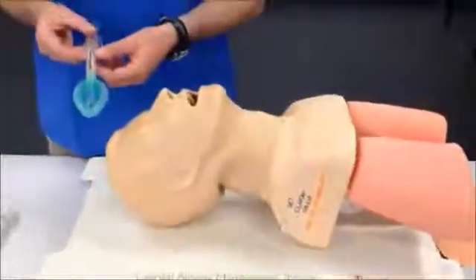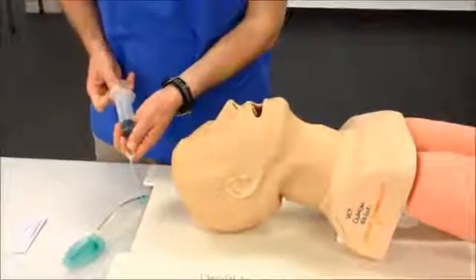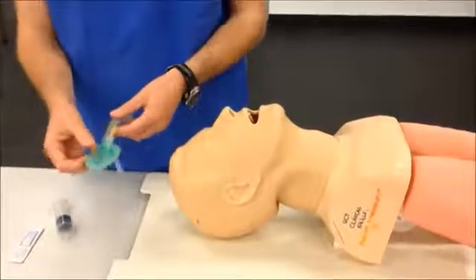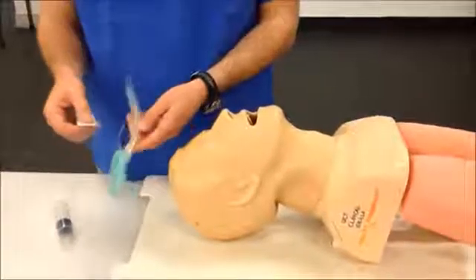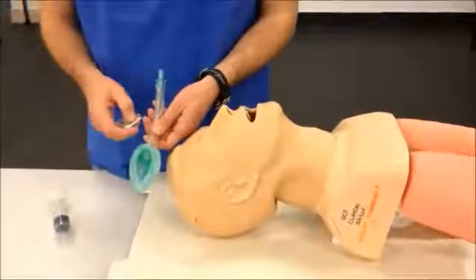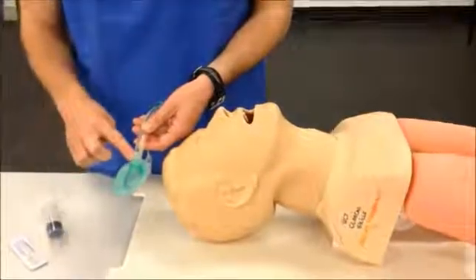Before using the LMA airway, make sure that the cuff is fully deflated and that there is no further air in it. Once the cuff is collapsed, the next step would be to use a water-based gel lubricant to lubricate the back of the LMA device. It's important not to lubricate the airway or front, as gel may obstruct the airway. Once the gel has been applied to the back, consider spreading it gently and evenly around.